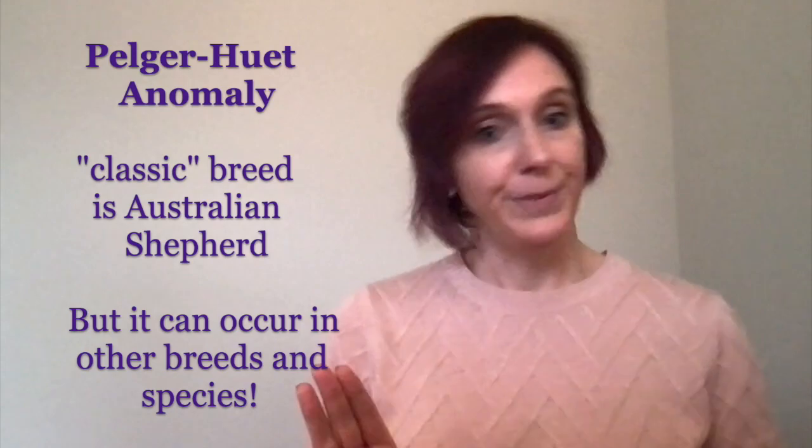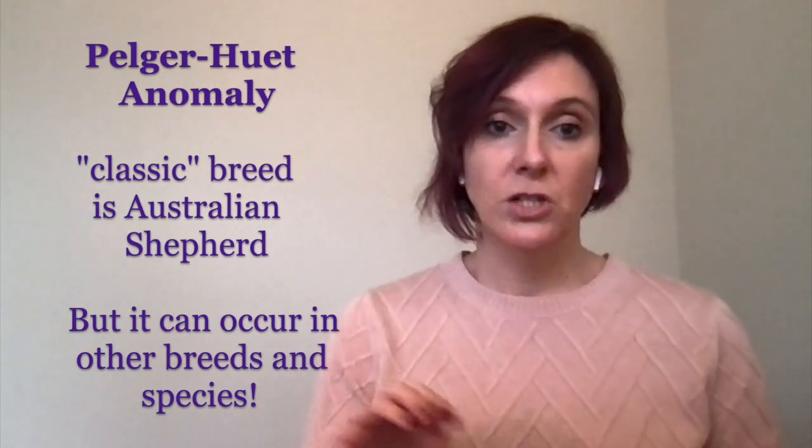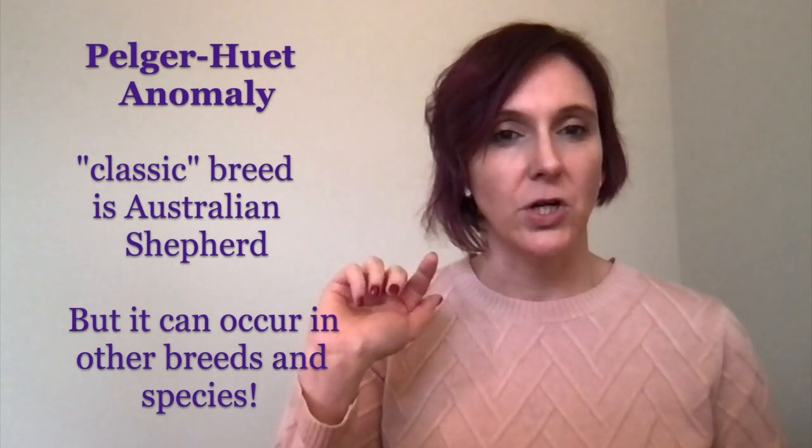It is definitely in people, so it can show up. It's something to sort of keep in the back of your cranium, and don't be fooled. These are nice, mature, healthy looking neutrophils. Their chromatin's super condensed like they would be in segmented neutrophils that are nice and mature.